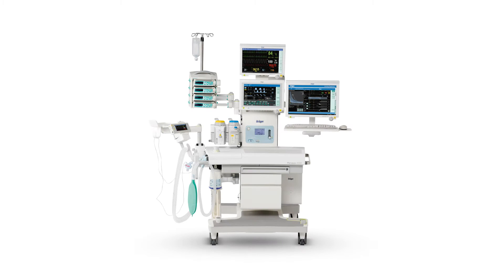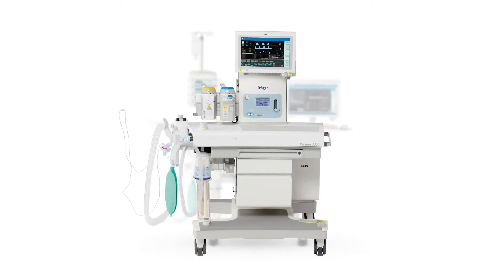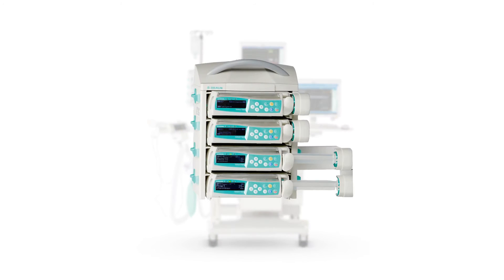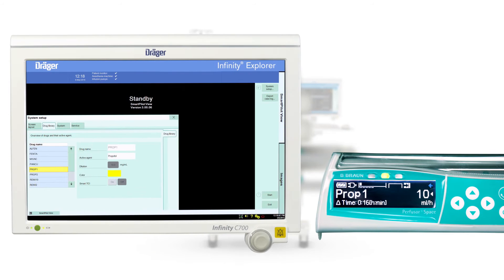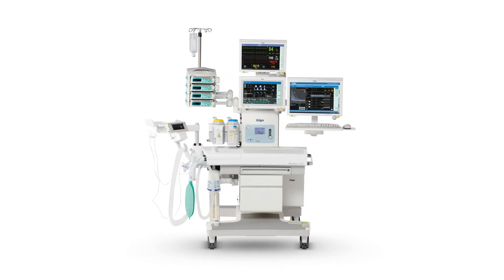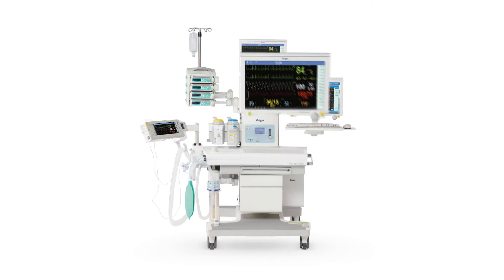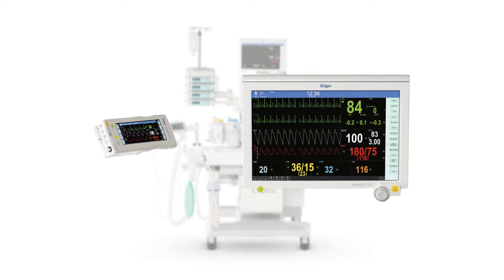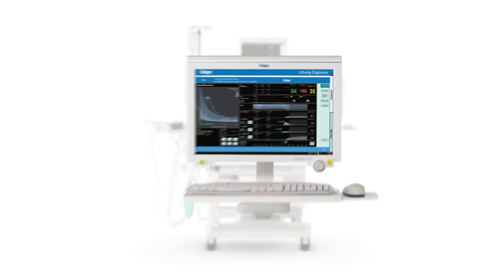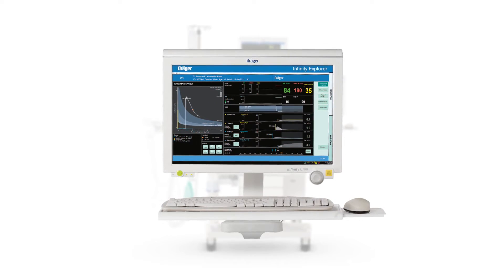Make sure that all the connected devices are switched on. Switch on the anesthesia device. Set up the pump according to the manufacturer's instructions and make sure that the drug library information of the pump and SmartPilotView are consistent. Switch on the monitor if applicable. Switch on the medical cockpit and start SmartPilotView.